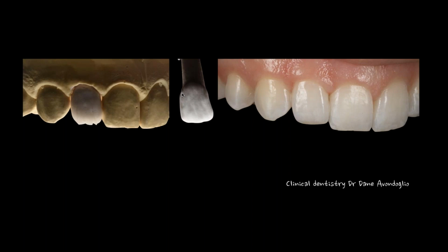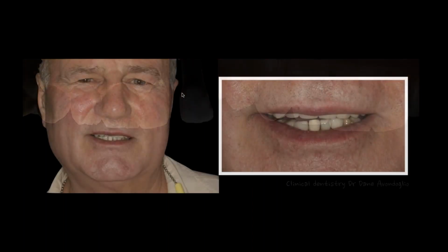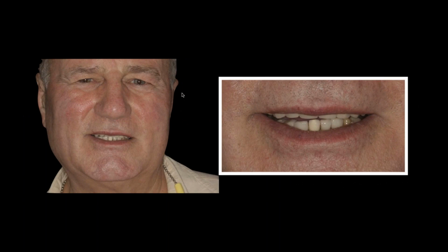And my friend Dr. Dane did a great job with the photographs and so forth. But the point of it is, when you have little space, I have to really be rethinking through my powders and which ones I want to use and not use. So let's look at some restorative, and I'll start to explain where the opacity part comes in so importantly.